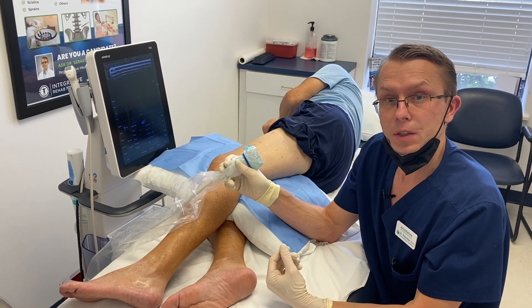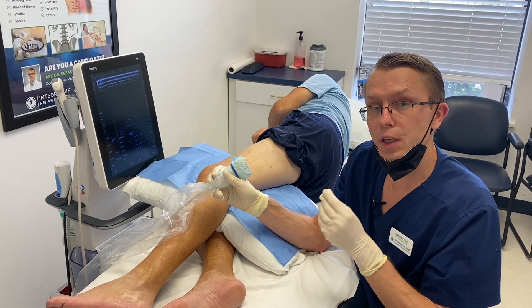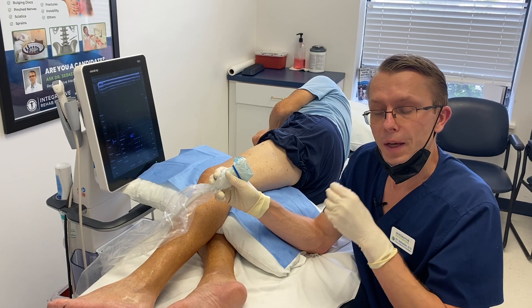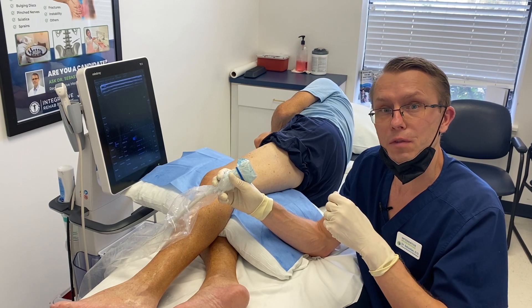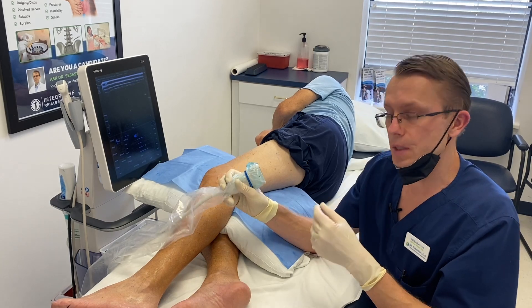We're going to do a hydrodissection with PRP. The hydrodissection is an injection technique where I inject fluid around the nerve to decompress it, allowing the nerve to be more free and allowing it to heal. The PRP injected around the nerve will allow it to heal, decrease the inflammation and pain, help the patient with the neuropathy, improve his function, and decrease his symptoms.